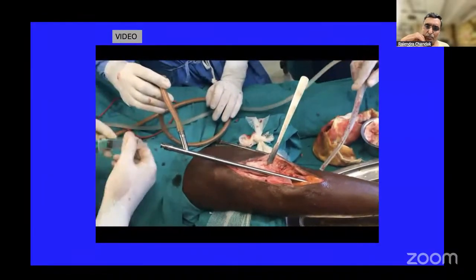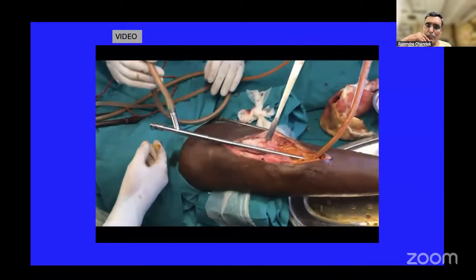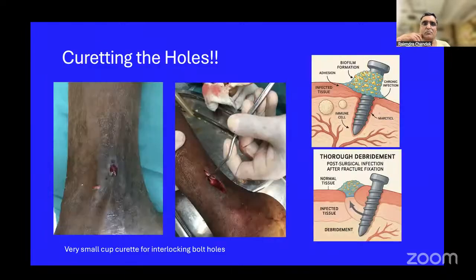Usually, I like to use peroxide many times. The only thing we have to take care of is that we do not pressurize the medullary cavity, so that the chance of an air embolism is minimized because of the air bubbling inside out. Otherwise, I have used it quite commonly and it is effective. Peroxide is the best material to remove the biofilm.